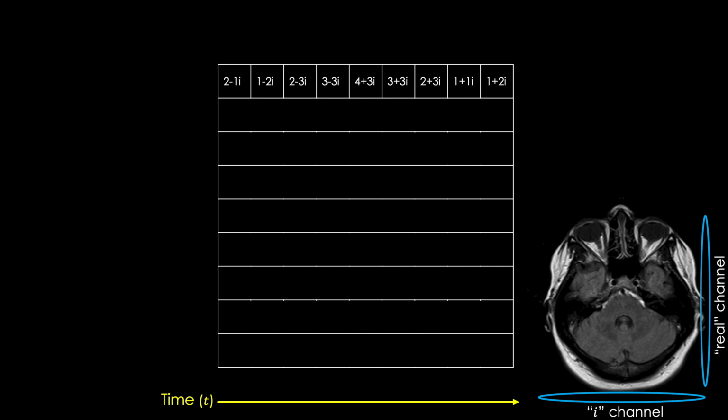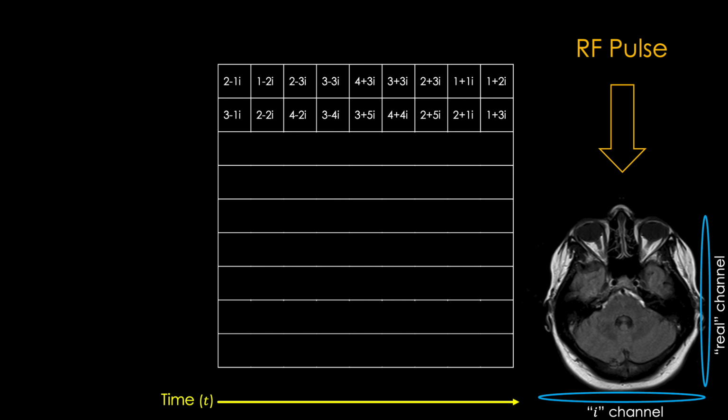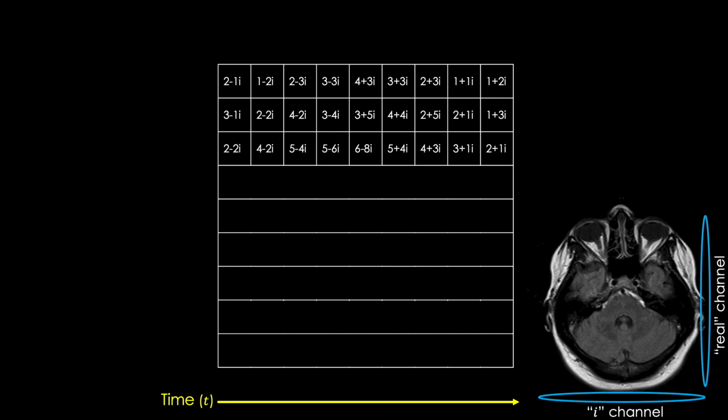We then repeat the process, starting a new cycle with another RF pulse, again applying our gy gradient, but this time using a different field strength, followed by more RF pulses or gradients to make the echo emerge, and once again, turn on our gx gradient and record the signal as the echo develops. We're going to repeat this process over and over, each time selecting a different gradient field strength for gy until we've recorded a nice mix of values as our data set.